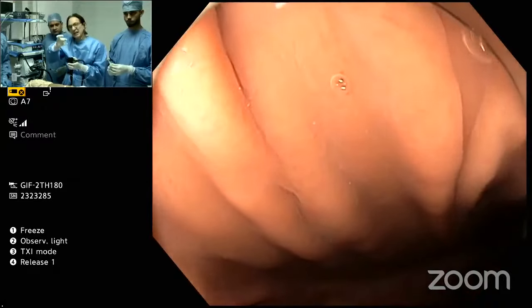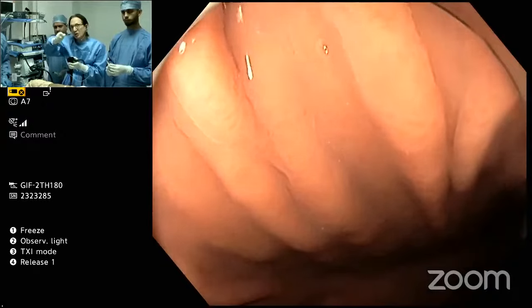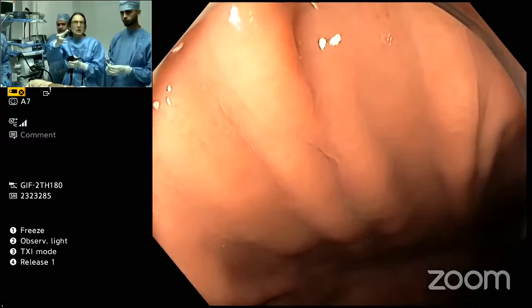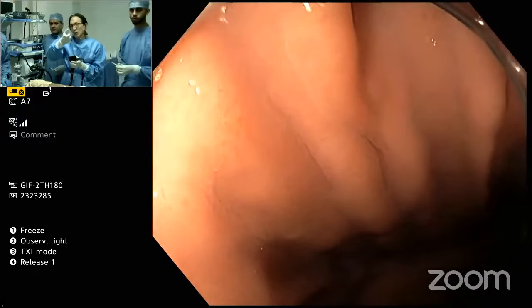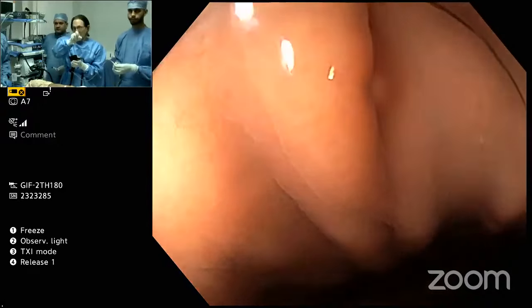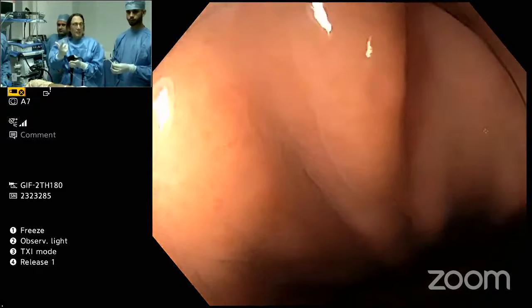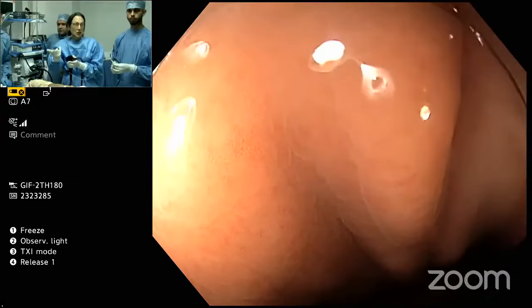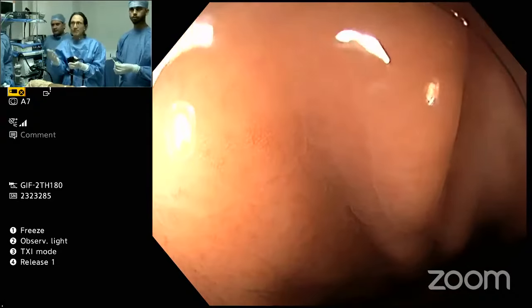It has like a hook on the end, and you can grab, and the idea is you close it, and that hook digs into the tissue, and then you open it up again. Then you go to the opposite side when you're closing a defect, and then you hook this opposite jaw, the prong, into the tissue, and then you deploy it. That's an improvement.